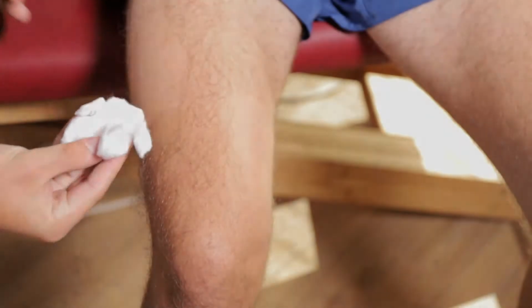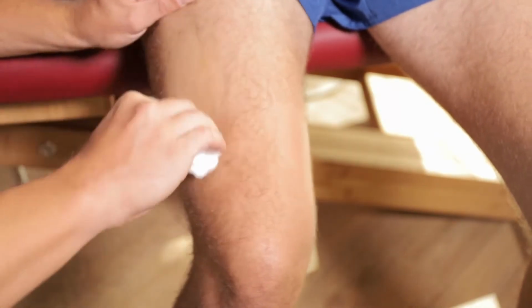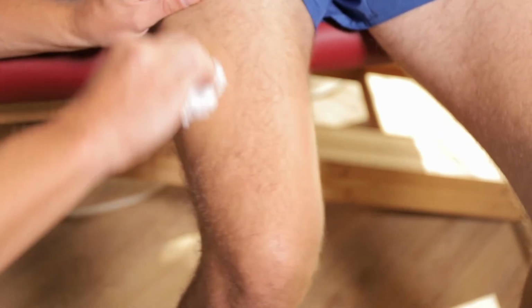For clinical use, it is recommended to clean the skin with alcohol. Pour the alcohol onto a cotton cloth and rub the skin with it vigorously. A little reddening of the skin is normal and desired.